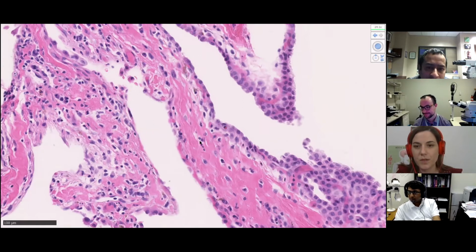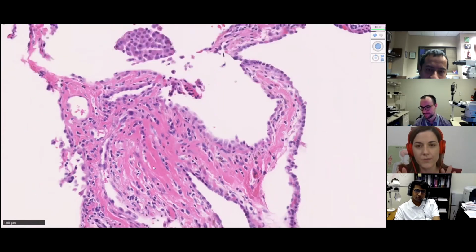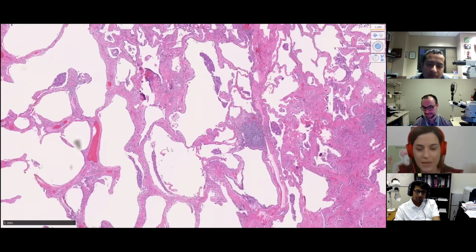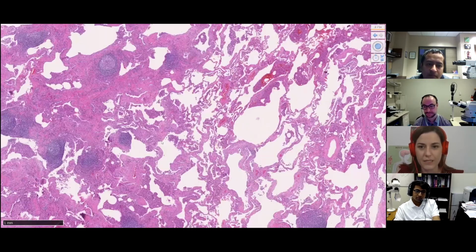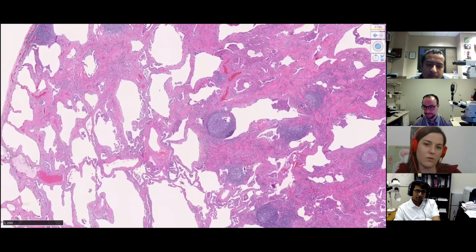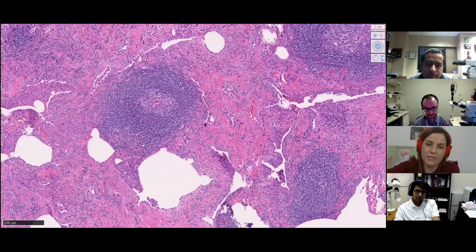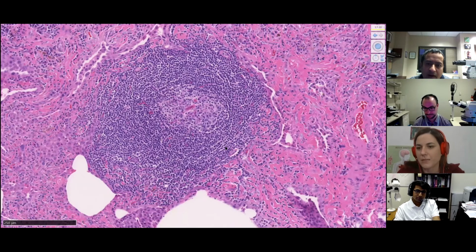What do you do? I would, if there is preserved lung, normal lung, I would call it UIP, because I think I can find NSIP-like areas in UIP cases. But if it changes a lot, I would maybe go just descriptive and say it's non-classifiable. And with the follicles, it's good for collagen vascular. Maybe sometimes they have not a good pattern, or not a classic pattern, or mixed.